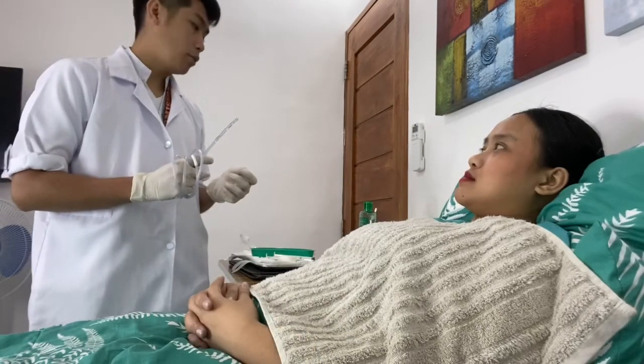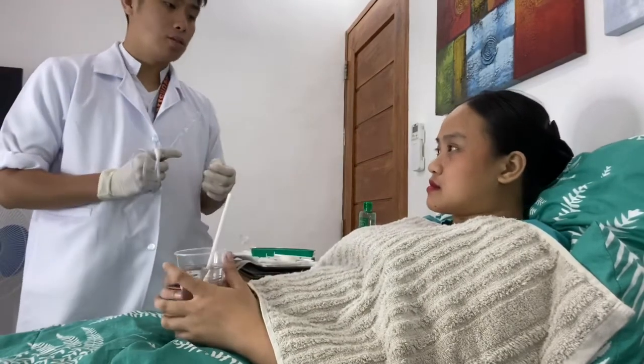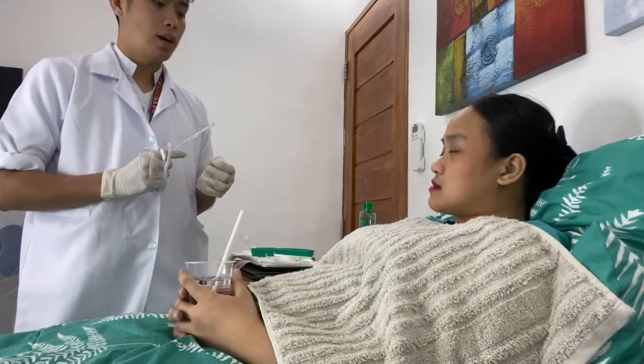Ma'am, I'm gonna start. Before that, here's a cup of water, and if you feel any discomfort, please raise your hand and take a sip. Okay.